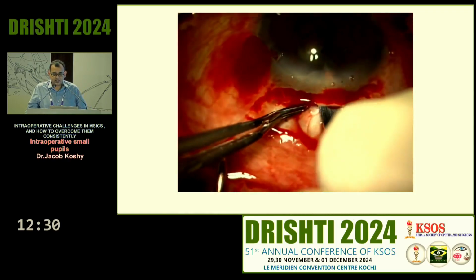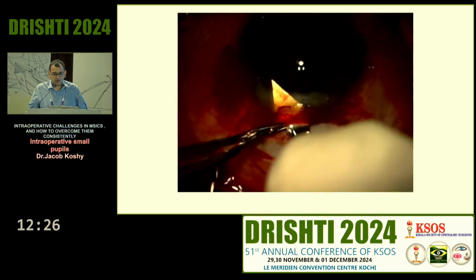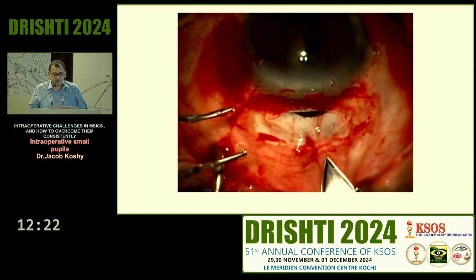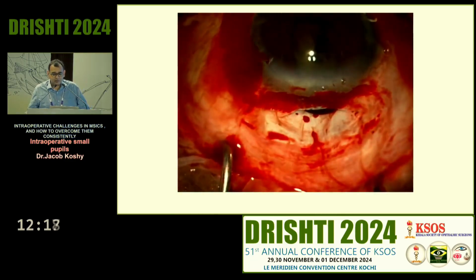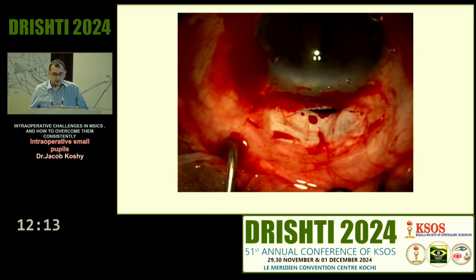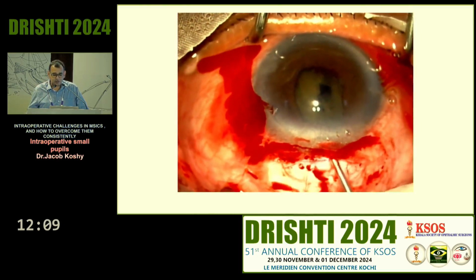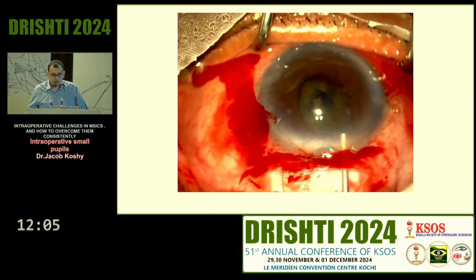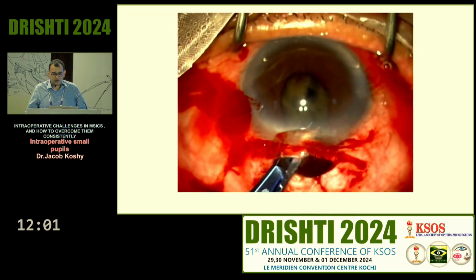I'll just manage it. I thought I have a good tunnel, and you can see about 2 mm into clear cornea. But as soon as I start making the tunnel, some iris is sticking out, and I'm hoping it's just the floppy iris and nothing much. So I thought, okay, put some visco in just on top of the iris, push the iris down, and you should be good to go. So you inject visco there, and you should be good to continue. And suddenly the whole superior iris is coming out, and you realize you're in trouble.